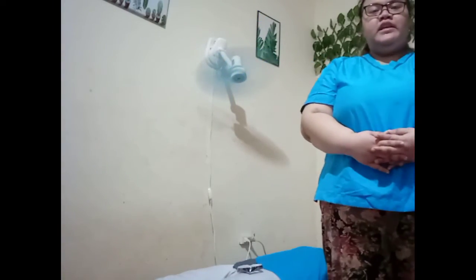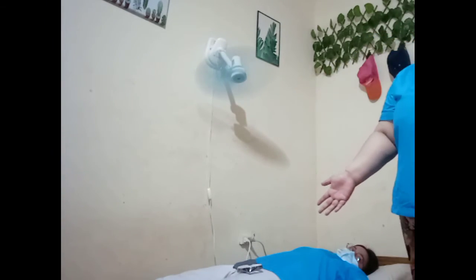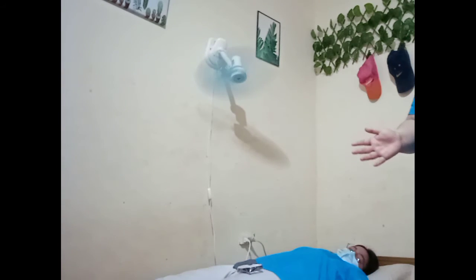Okay, so now we will go ahead and proceed to the lateral projection of the femur. Again, the patient will be in a recumbent position. The IR size will be the same, we will be using 14 by 17. And for the SID, we will be using 40 inches as well.